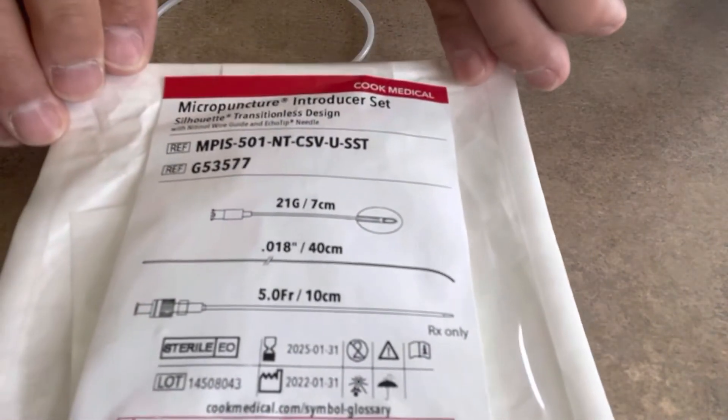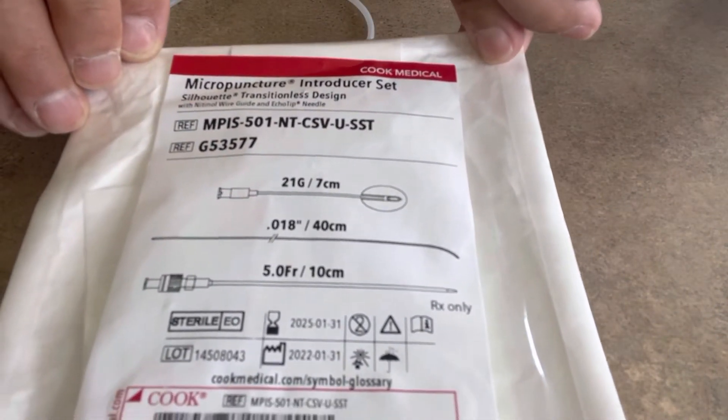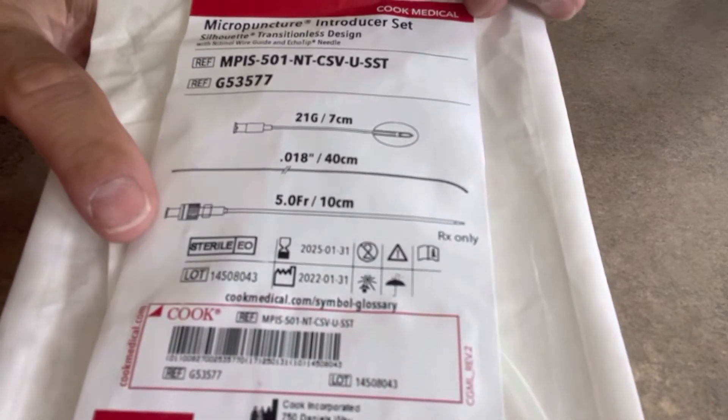These things were obtained from this kind of kit, a micropuncture introducer set. These are the important parts, the wire itself, which is 0.018 inches, and the 5 French dilator.